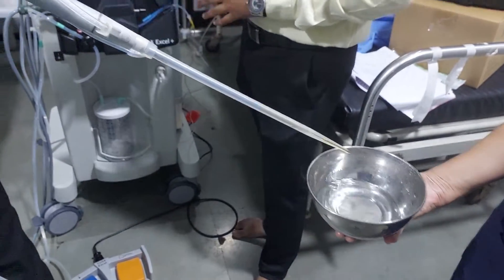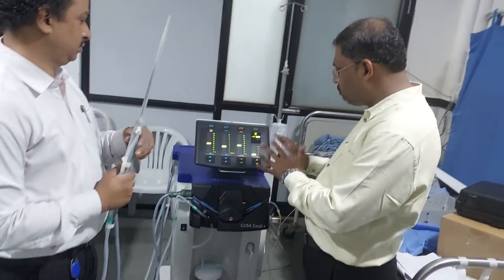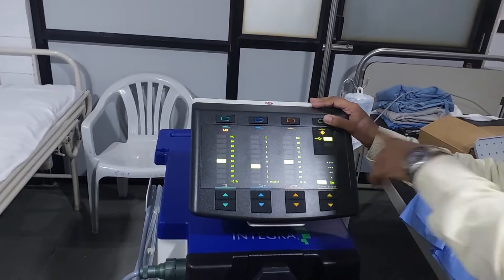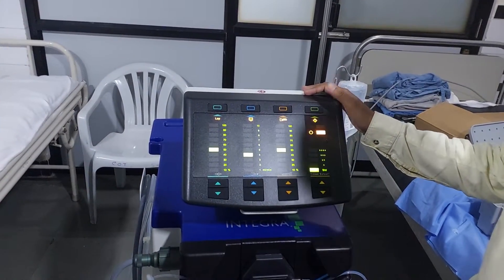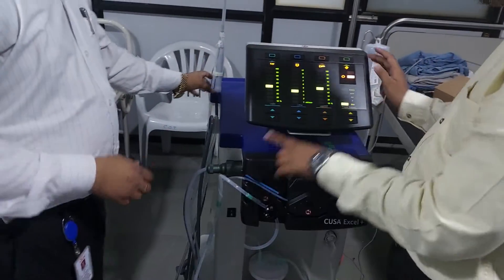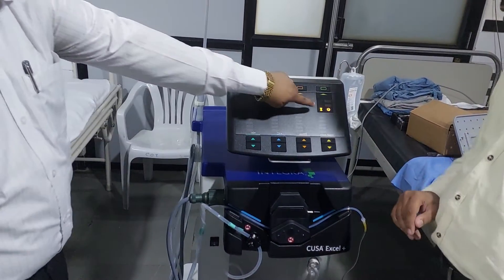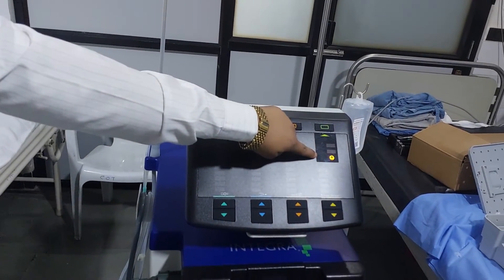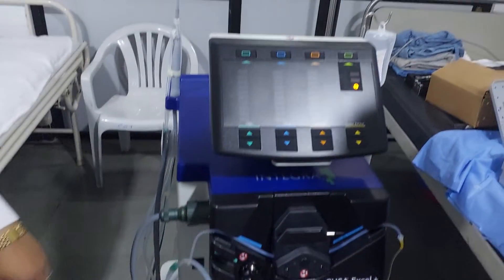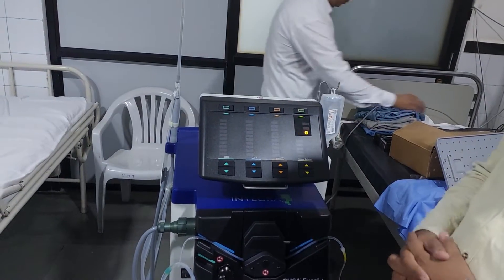This is the basic arrangement before surgery for the CUSA. Now how to switch off the machine: before switching off, first make it go to standby mode using this switch. After standby, close the main power supply, but you have to wait for some time. You will see a waiting sign; by that time you can remove the suction valve only. Wait for this procedure to complete before dismantling accessories connected to the CUSA.